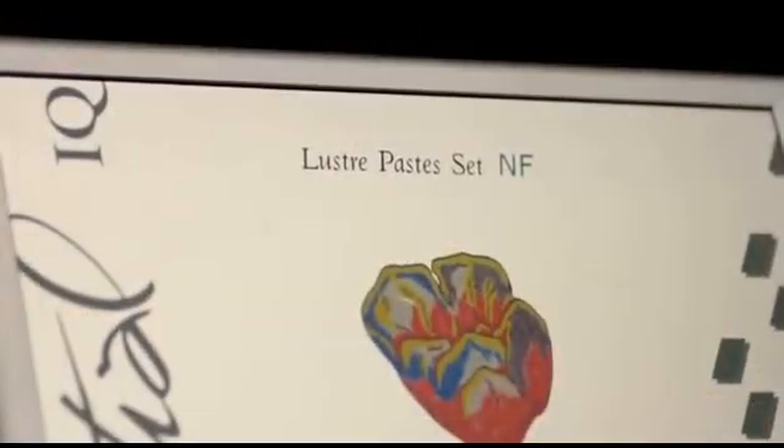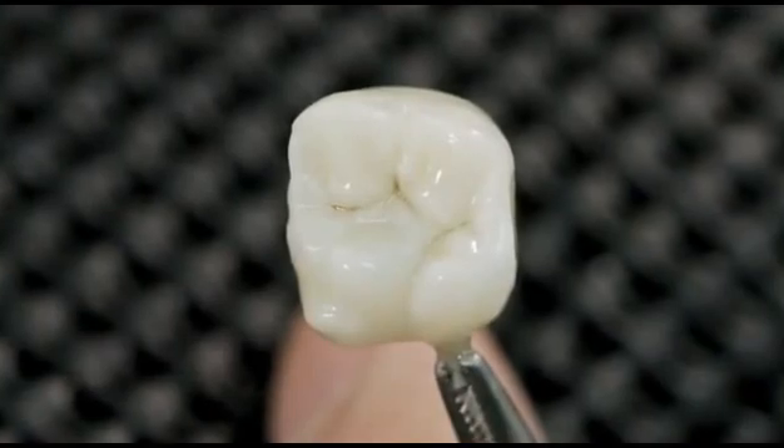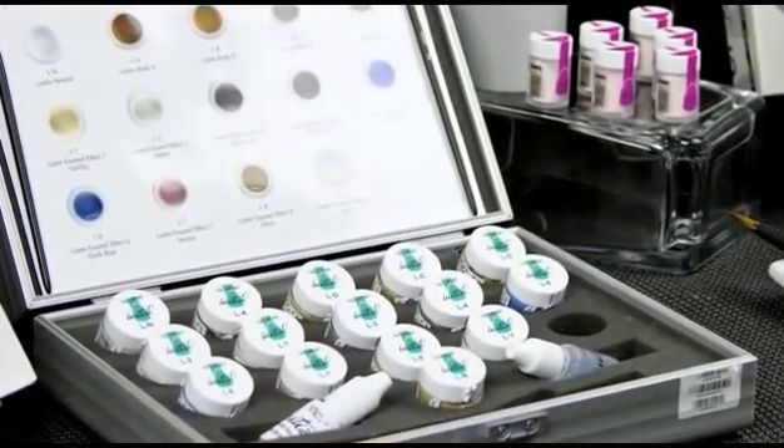GC Initial IQ Lustre Paste NF are three-dimensional ceramic paste developed to bring color depth and lifelike translucency for the complete GC Initial ceramic range. Thanks to their new formula, you can now really bring your crowns and bridges to life with this dedicated Lustre Paste NF set, with an optimal match to both low and high CTE ceramics.